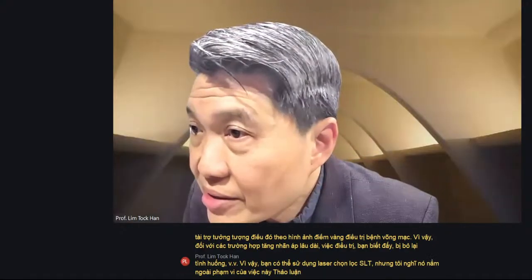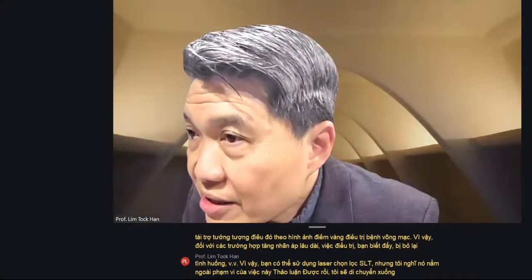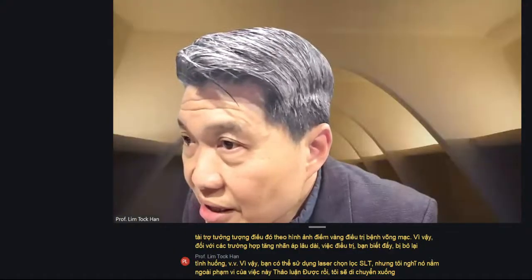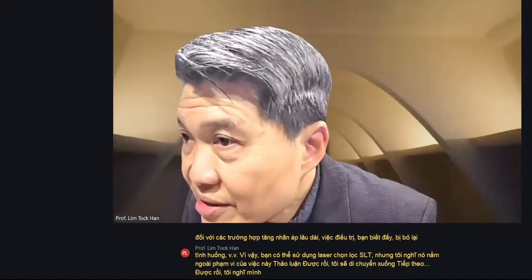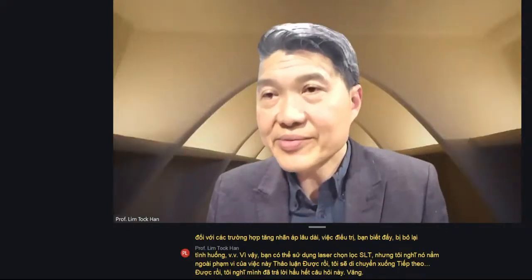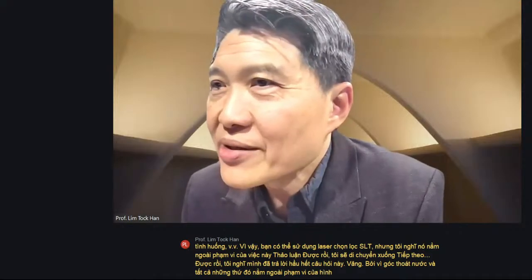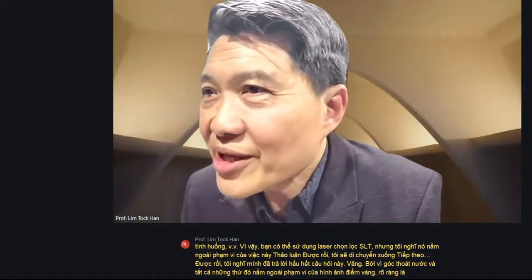Okay, I'm going to move down to the next. I think I have answered most of this, because drainage angle and all that is beyond the scope of macular imaging, obviously. So I'm afraid I can't help you with that.